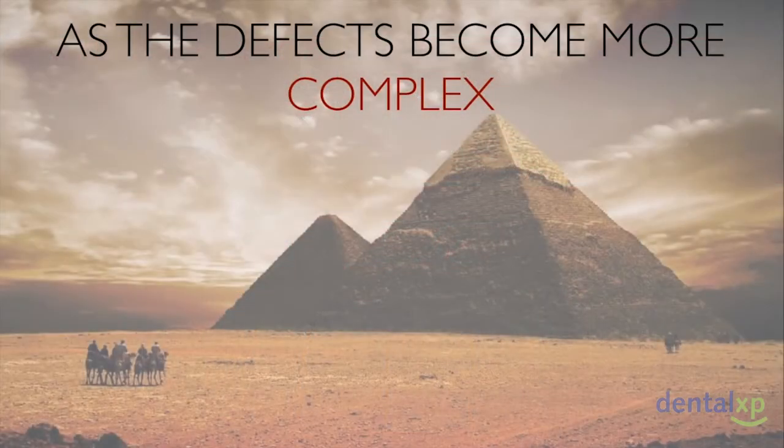So as you can see, with defects that are less demanding in terms of their augmentation requirements, we are able to achieve a decent result with minimal tissue manipulation. However, as the defects become more complex, the augmentation demands and number of procedures needed are also increased, which may eventually compromise or have a negative impact on the final aesthetics of the case.